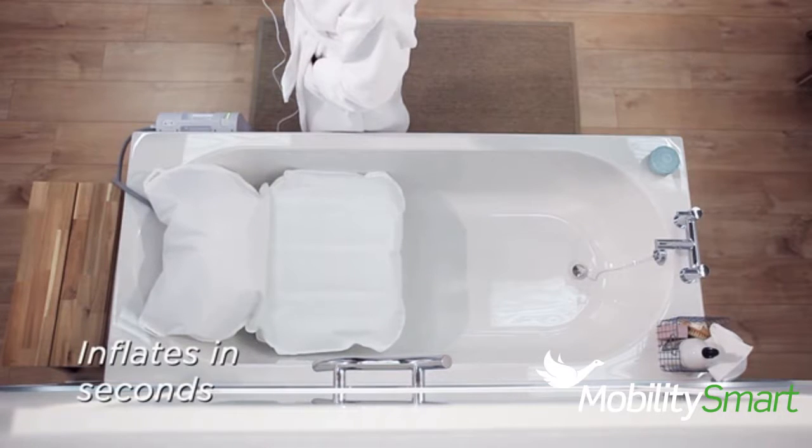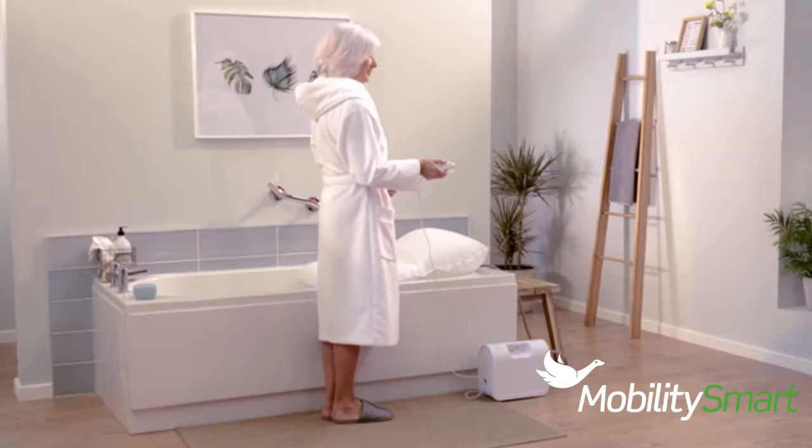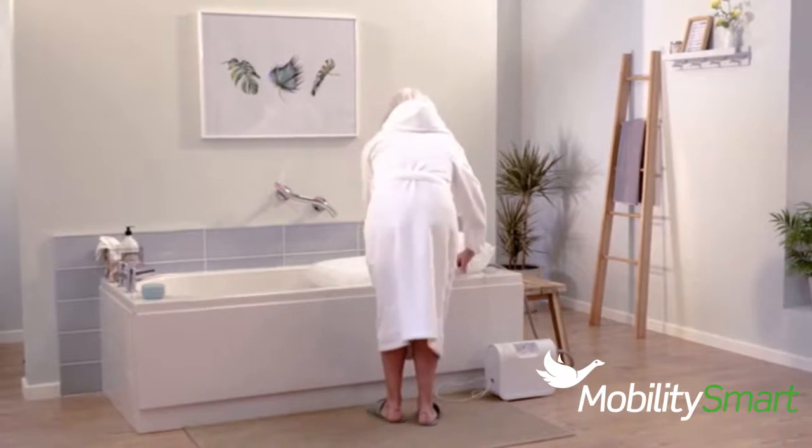The waterproof handset is easy to use and inflates the bath lift in seconds. The special cushion fabric is soft, but very strong and hard-wearing.